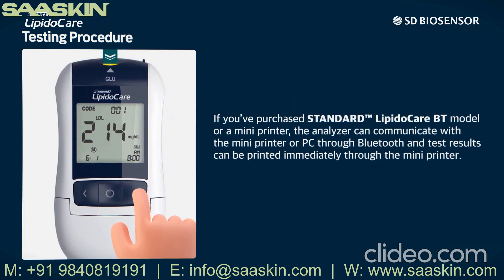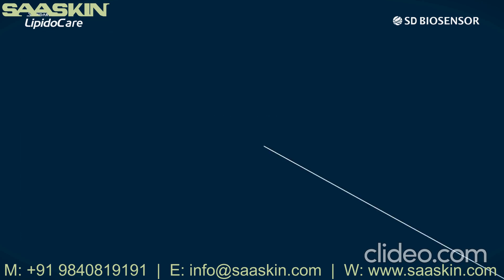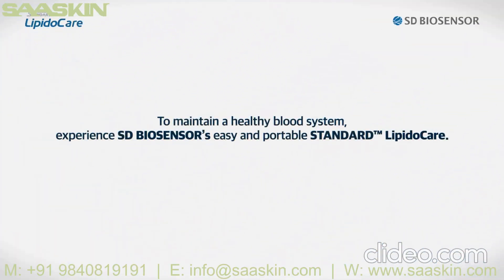If you've purchased the Standard LipidoCare BT model or a mini printer, the analyzer can communicate with the mini printer or PC through Bluetooth and test results can be printed immediately through the mini printer. To maintain a healthy blood system, experience SD Biosensor's easy and portable Standard LipidoCare. Take care.